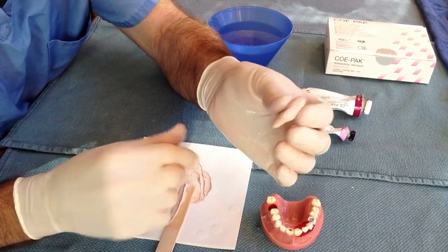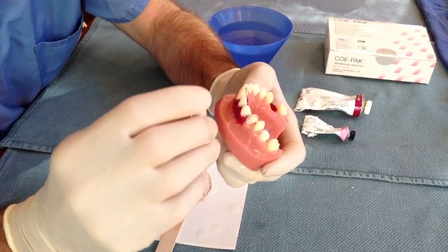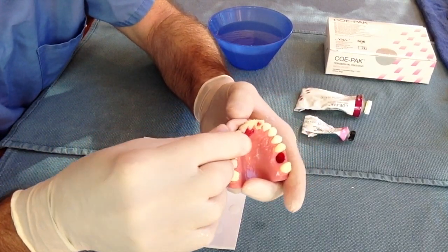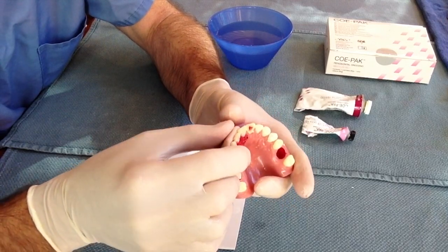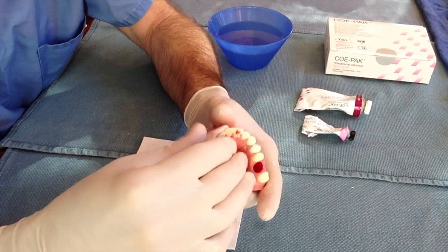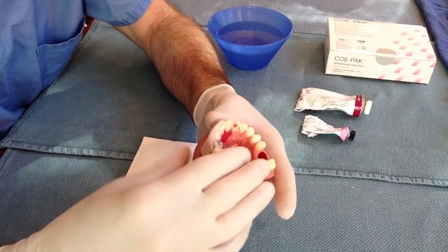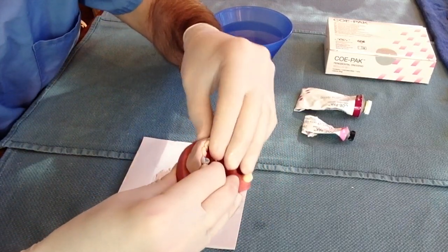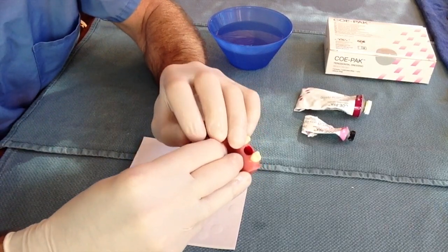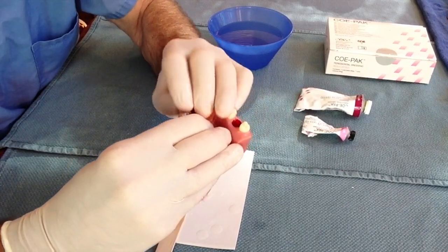Once the Copac is rolled up into the shape of a cigar, it is ready to apply to the teeth. When applying to the teeth, remember to extend the Copac to one stable tooth on each side of the loose tooth. It is applied to both the gingiva as well as the enamel. Remember, the gingiva and the enamel must be dry. If there is blood or saliva on the teeth, the Copac won't stick, so make sure the teeth are dry. Try not to get the Copac over the occlusal or biting surface of the tooth, as this will interfere with the patient's bite.